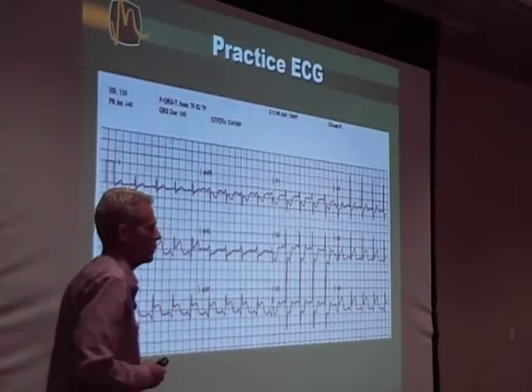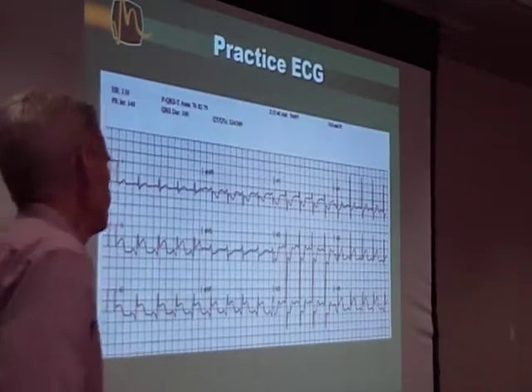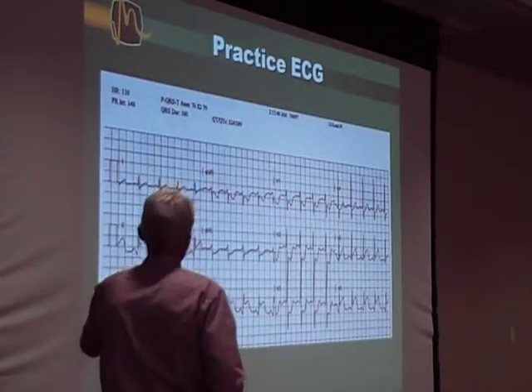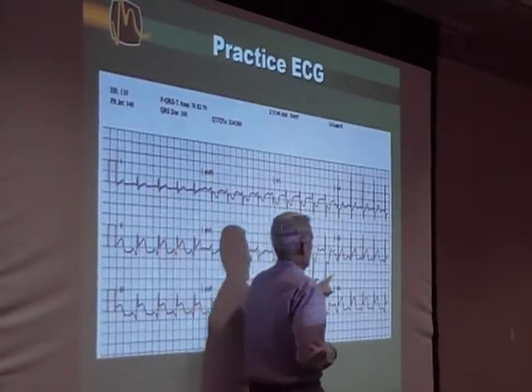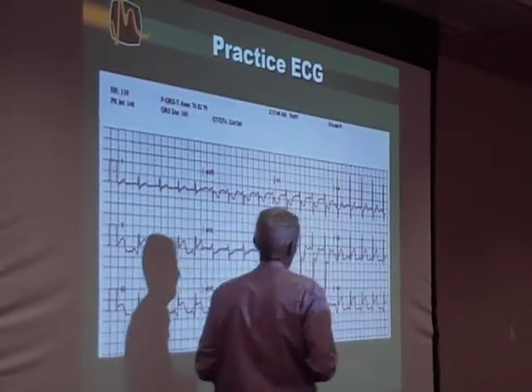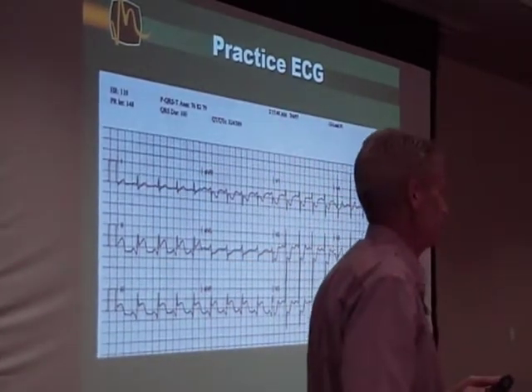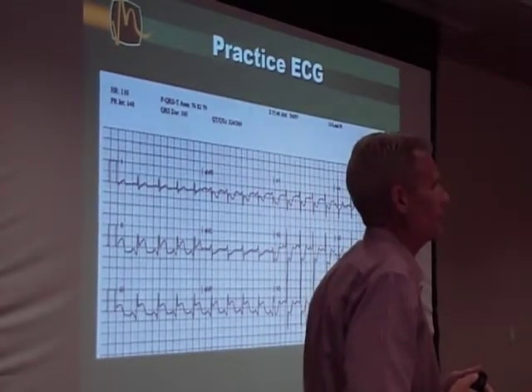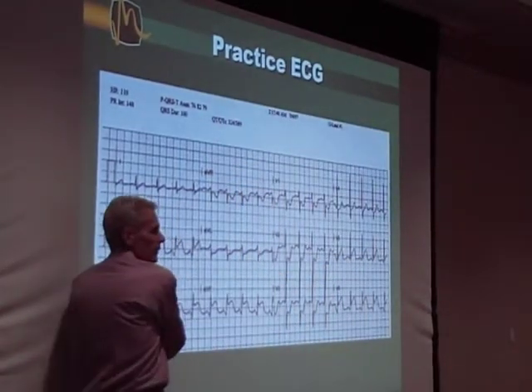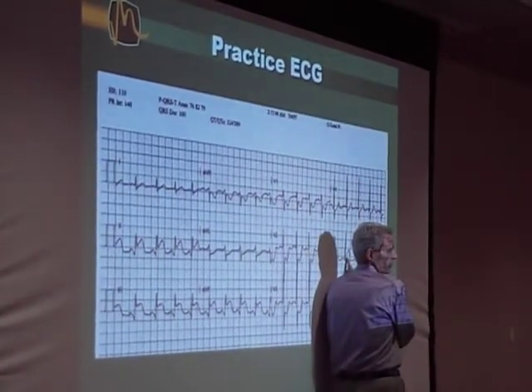So take a look at the EKG on page 20. Does everybody see the inferior wall MI here? You also see lateral elevation. So here's an inferolateral injury. Now, based upon what you guys know about coronary artery feeds, why doesn't that combination make sense? Inferior wall is fed by the right coronary vessel. Lateral wall is fed by the left circumflex.